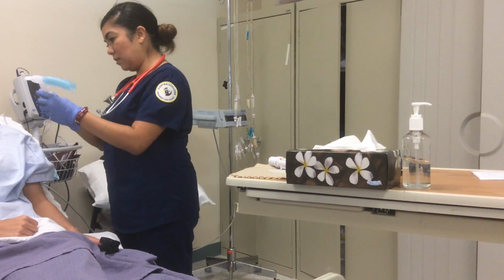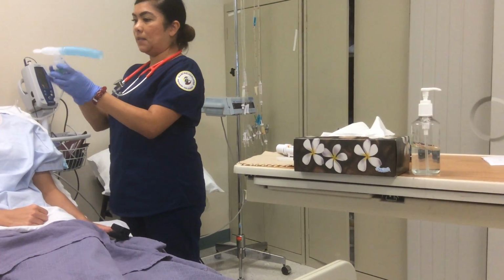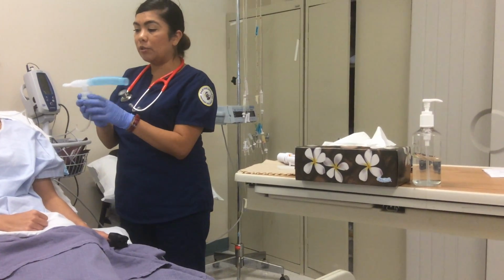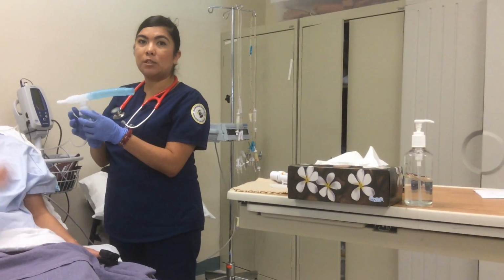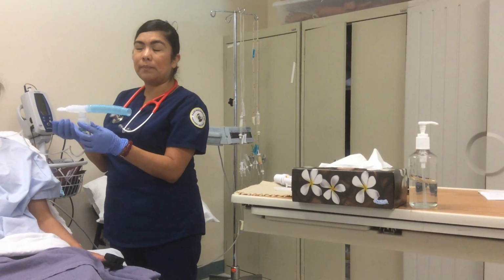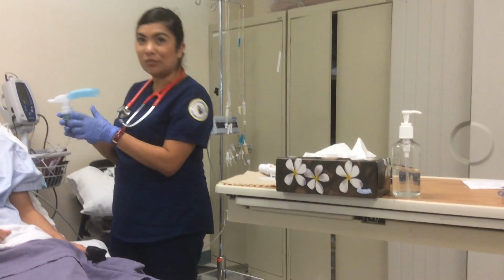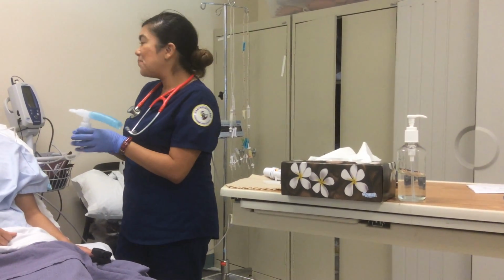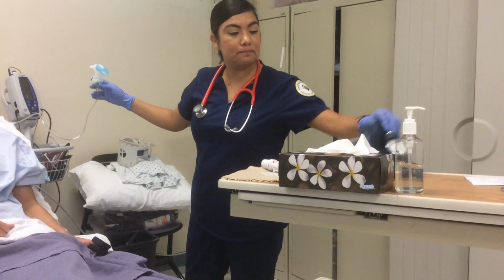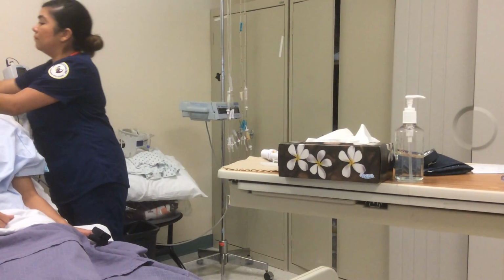Okay, so let me just see here. But before I continue, can I have your first name, your last name, and date of birth? Okay. So the reason that I'm checking is we just want to make sure the patient received all of the medication. Okay, so in this case she did. So I'm just going to put this right here.